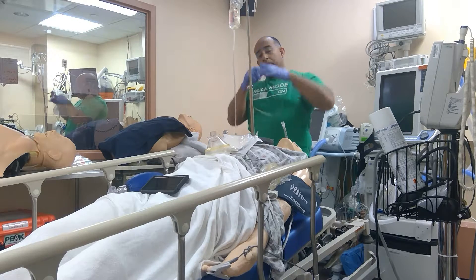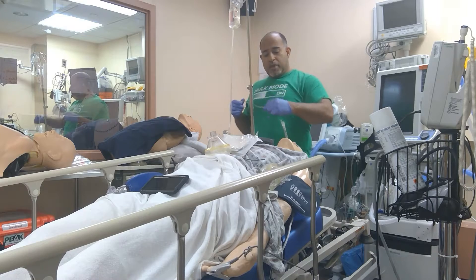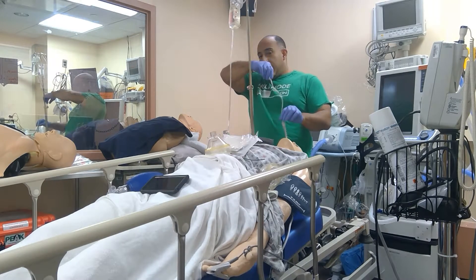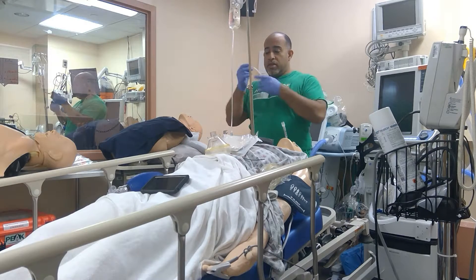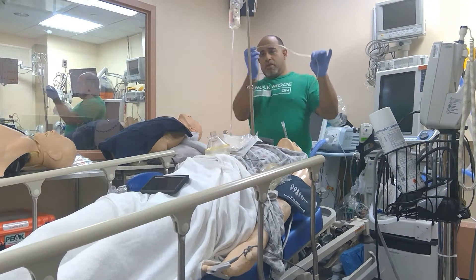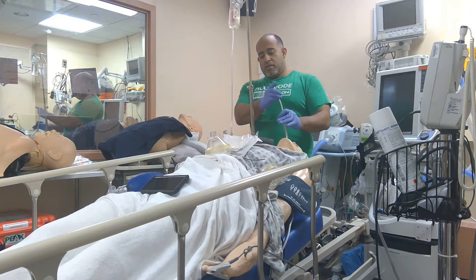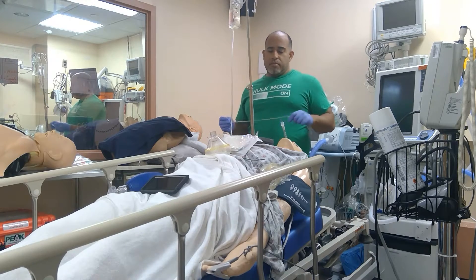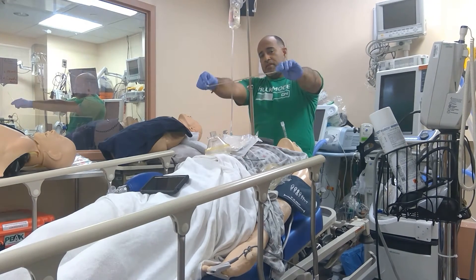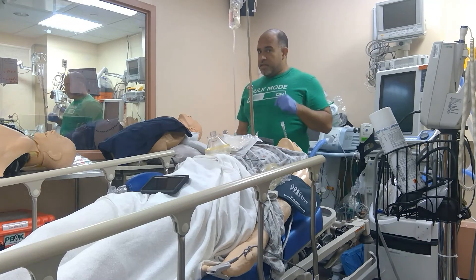Some patients have mucus plugs that form like a film right on the airway wall, build up, and cause an obstruction. A mucus plug loosened from the lower lungs can also migrate up — this technique can confirm that. This is the poor man's fiberoptic scope. If it's not letting you pass and there's no clenching, something's wrong along the tube. This catheter is longer than the ET tube, so if something's blocking it, you may need to change out the tube. Tactile sensation is very essential — even Helen Keller can use this technique.